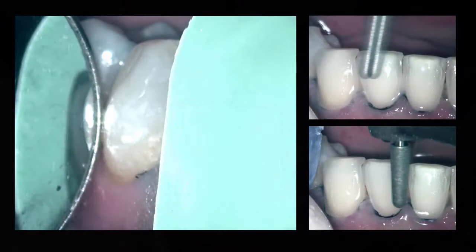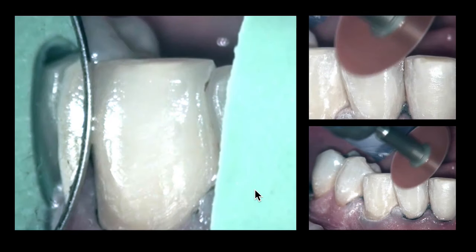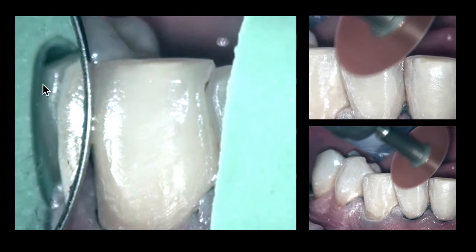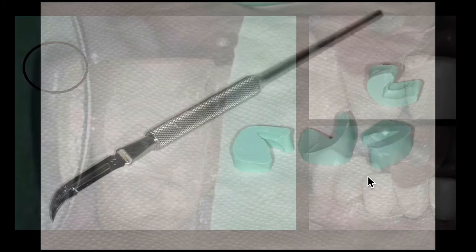So I like to use soft flex XT discs. Another popular one for me is the enhanced cups and points. Here's the cuspid — I was too close at the incisal-body third area. We just reduced with this large KS diamond, which is what we use for areas where we're close to the matrix and close to the surface of the proposed veneer. And then to round out this corner, which is really sharp, we round it out with the soft flex XT discs or enhanced cups and points.